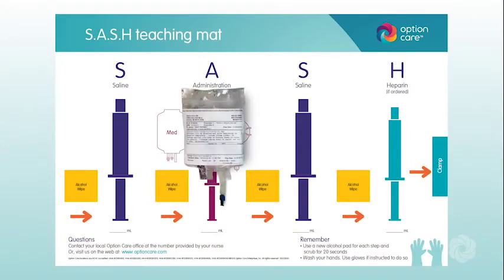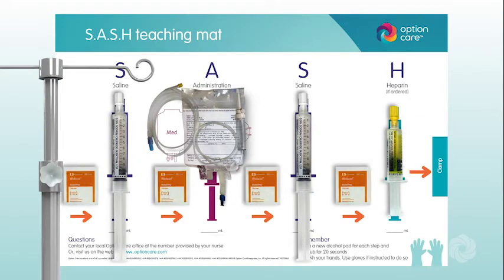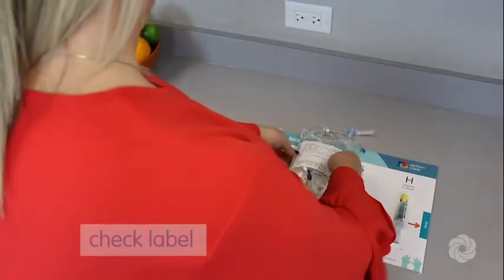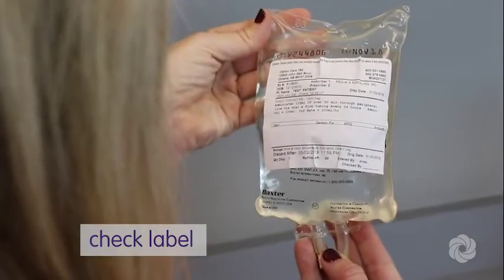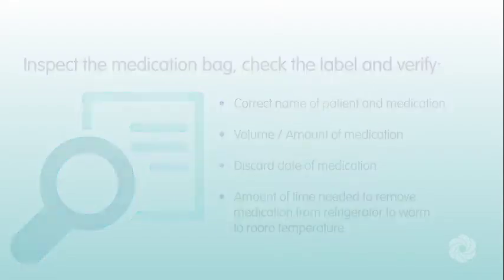IV medication bag, IV tubing, IV pole, flush syringes, alcohol wipes, and, if necessary, sharps container and/or trash container. Inspect the medication bag. Check the label and verify: correct name of patient and medication, volume, amount of medication, discard date of medication, amount of time needed to remove medication from refrigerator to warm to room temperature.